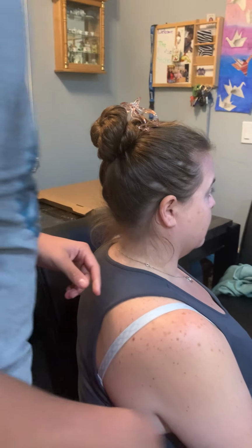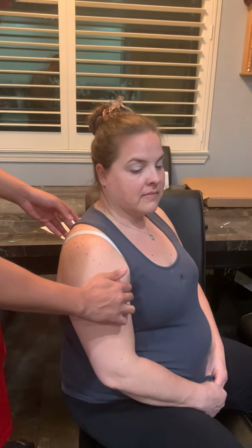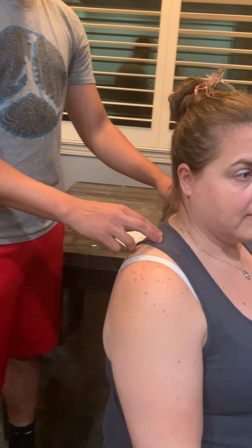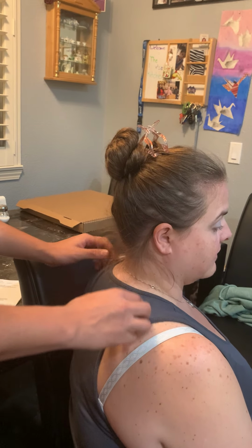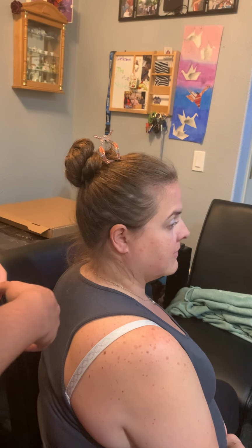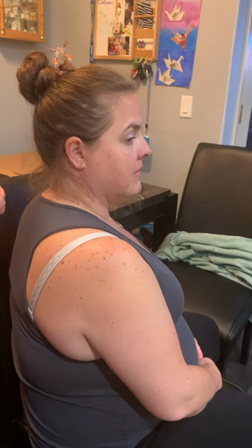Then we have the biceps right here, and the coracobrachialis right here. Then we have the levator scapulae right here, which goes right here. And go ahead and shrug. That's what allows you to get shoulder elevation. Then we have the serratus anterior, which is down here, and it's these finger type muscles.